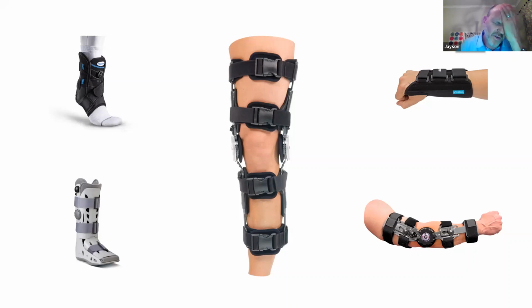A lot of orthotics are really very useful in the early stages of rehab where the person is dying to get back to activity, and it's often at this point where your surgery is really only settling down, and using an effective orthotic can really help the person return to function, using the leg with confidence and better load bearing and better body balance, and improves the function.